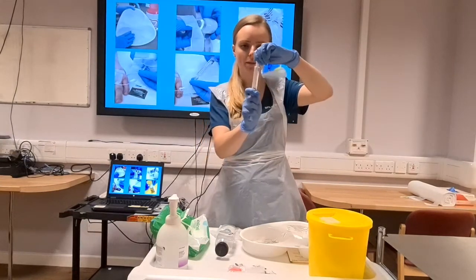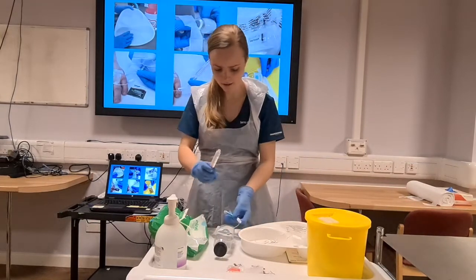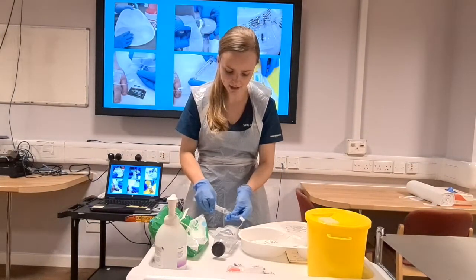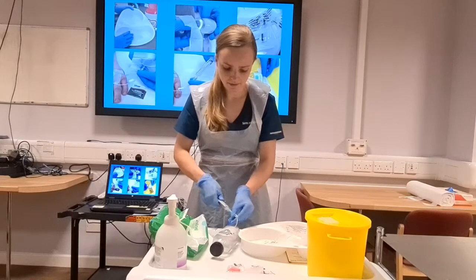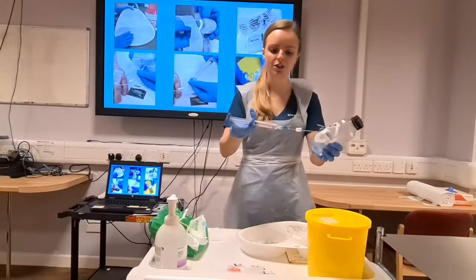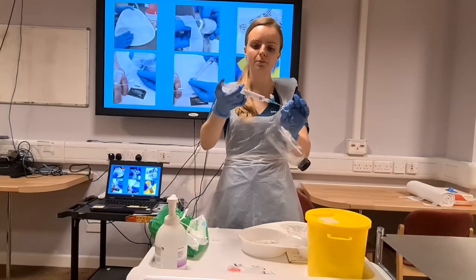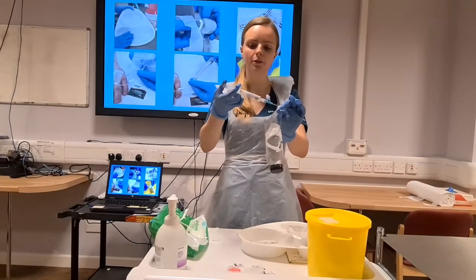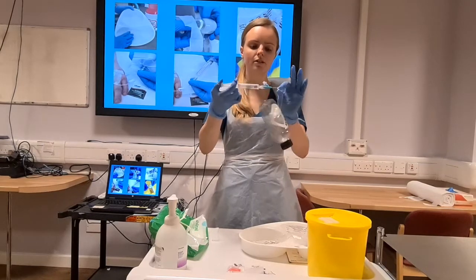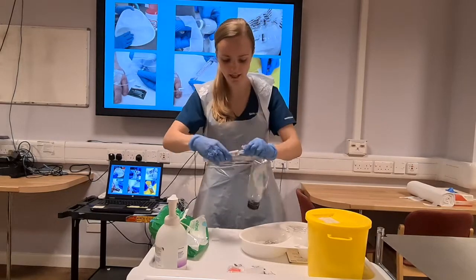Going to remove the air bubble. Go into the hub that I have cleaned. Unclip. And I'm just going to use the push-pause technique. So push, pause, push, pause, push, pause, push, pause, push, clip. On that last push you want to clip so that you've got that positive patency.